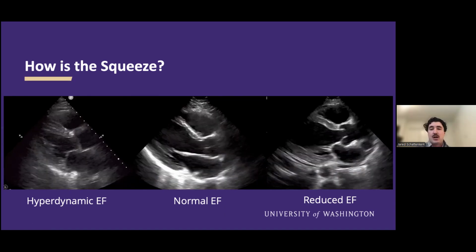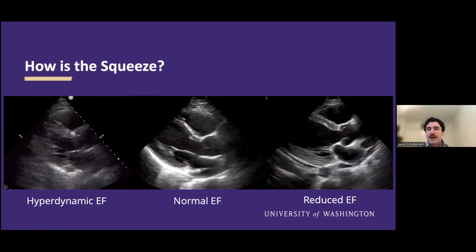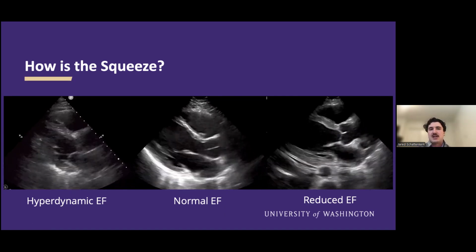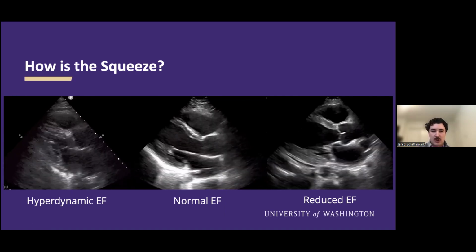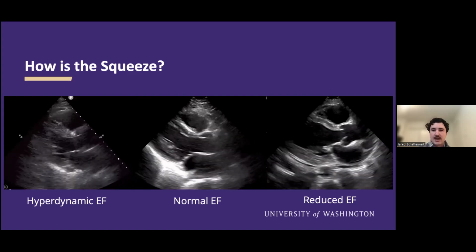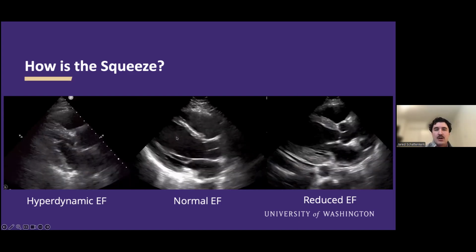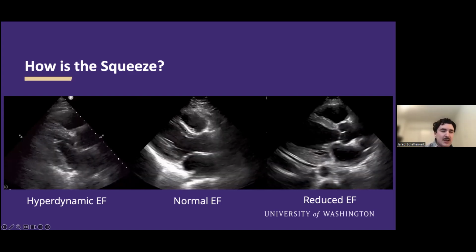Which is obviously a pretty qualitative assessment. And so things you can look at in doing a qualitative assessment of someone's left ventricular function is like how close are the left ventricular walls coming together? Do they generally seem to be squeezing well?